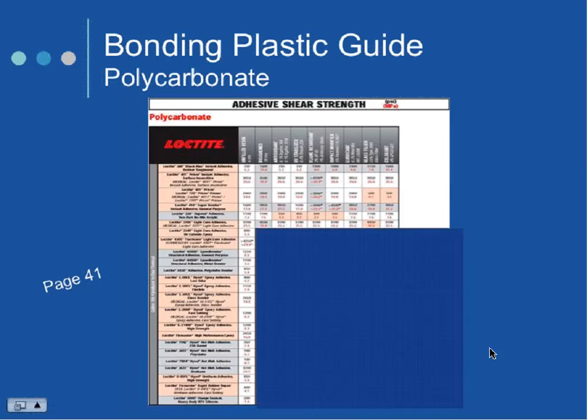So as you keep going across, we're adding all of these different things to it. They're one-offs, if you will. So first we measured unfilled resin bonded to itself. Then we did roughened to itself. Then we added an antioxidant.